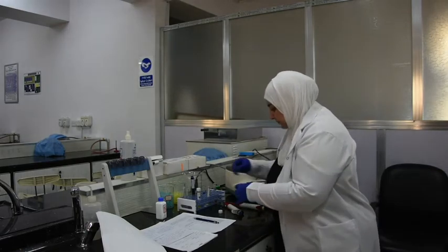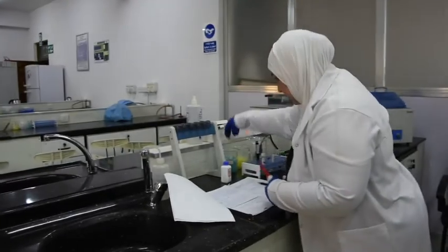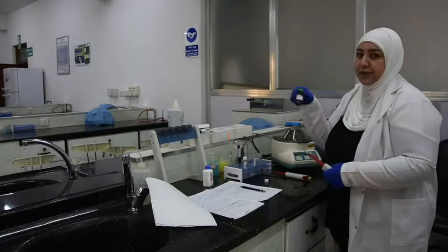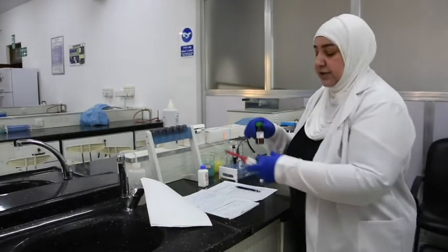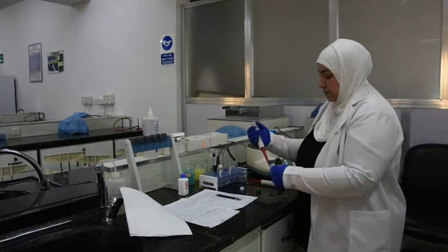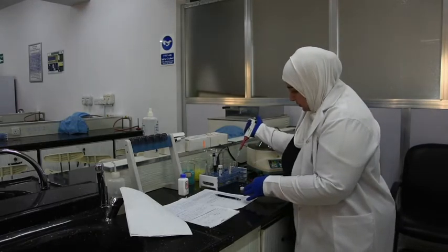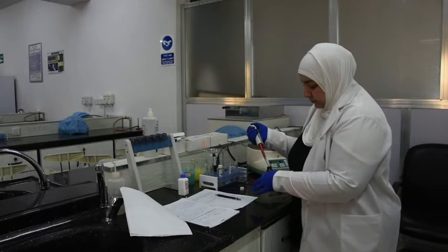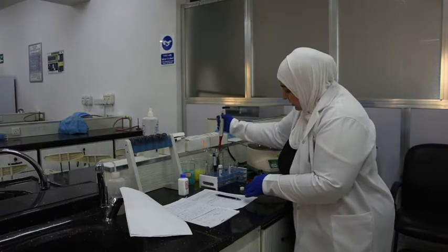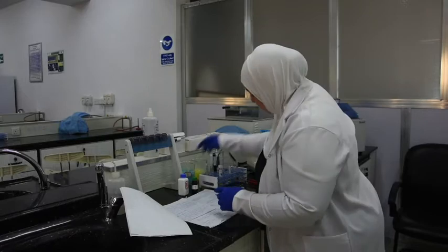And then we need 1,000 microliter of cholesterol reagent, the cholesterol reagent, as in part 2 of the test.